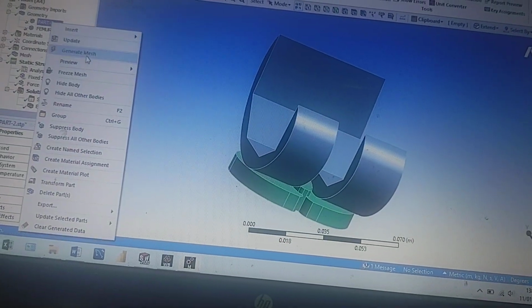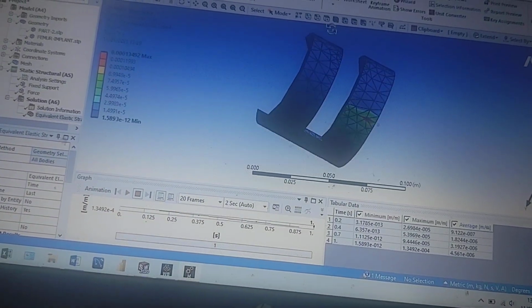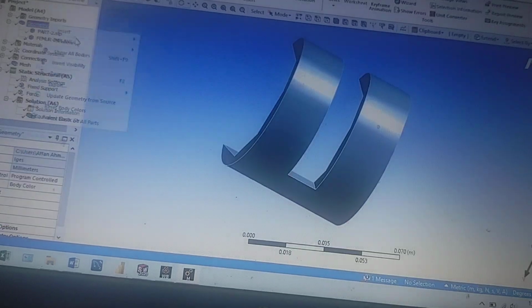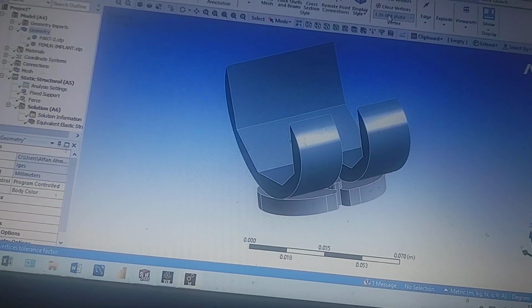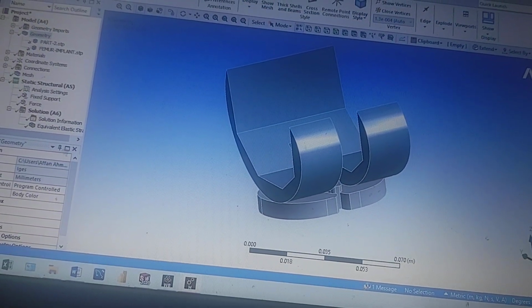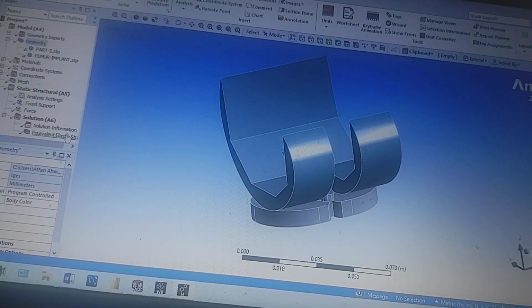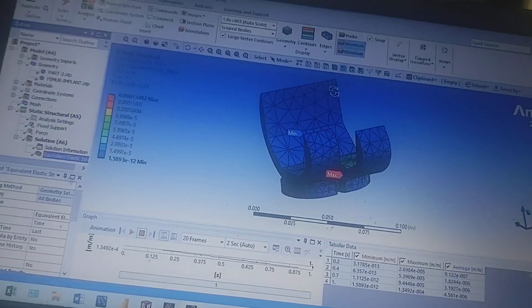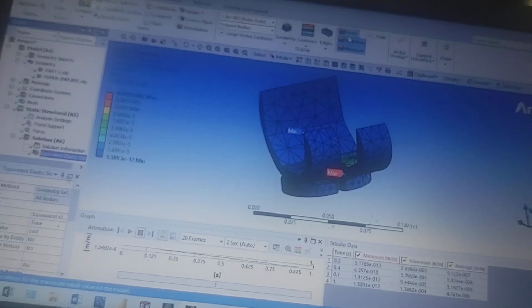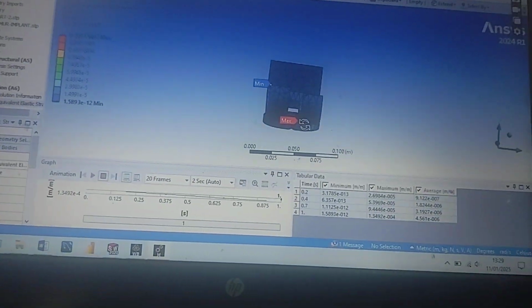If you want to hide this, go and hide body, then go to the maximum stress or show all bodies. If you want to find maximum and minimum stress, you can go here. Where to find maximum and minimum stress? In the result, minimum and maximum, you can use the probe to find this. The maximum stress is clearly shown here. Researchers have also obtained maximum stresses here, so our results are verified.